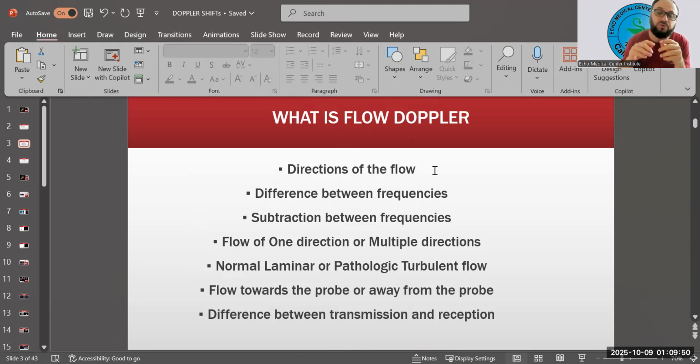For example, you're looking at a four-chamber view of echocardiography of the heart, the apical four-chamber. We know the normal direction is that the flow from the left atrium goes, in diastole, to the left ventricle, and then when diastole is done, the mitral valve has to close completely. If you see that the flow is coming in the opposite direction through the mitral valve, it means something is wrong. We call it mitral regurgitation or MR, or an insufficiency. It's just an example I'm giving you.